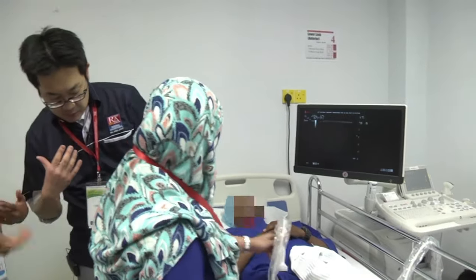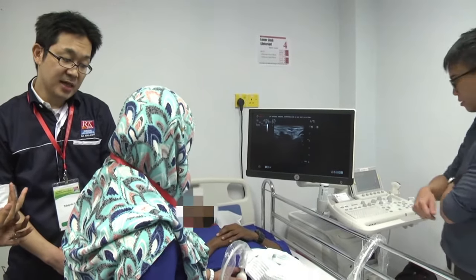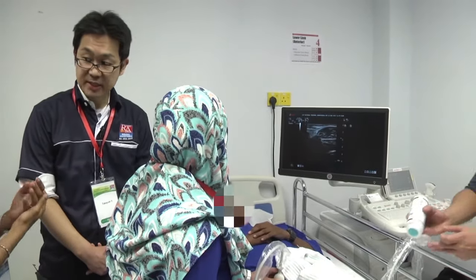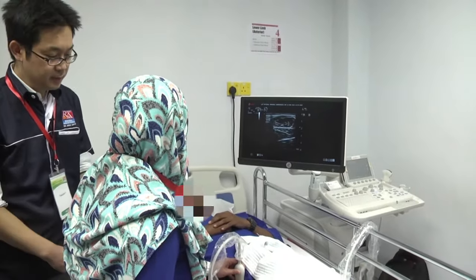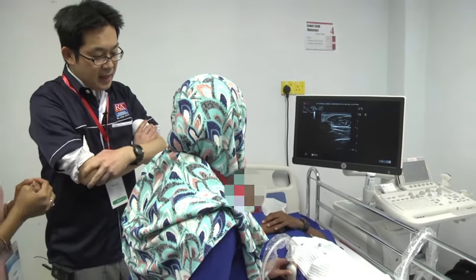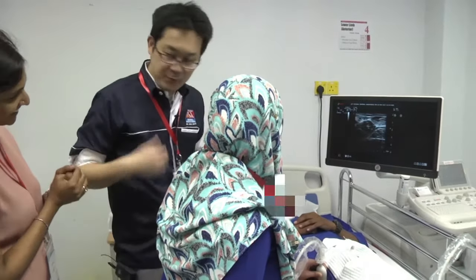For knee surgery, any knee surgery, you just get the adductor canal? Yeah, it works as analgesia for any knee surgery, but doesn't work as anesthesia. Say like a TKR, you would be happy with just this. Yeah. After that, I will explain.